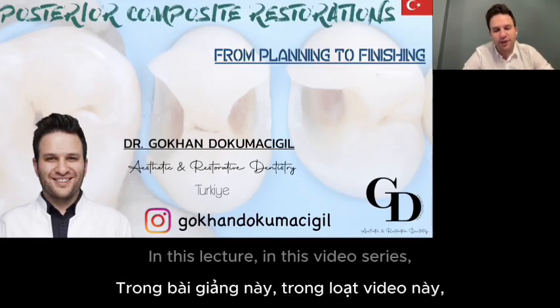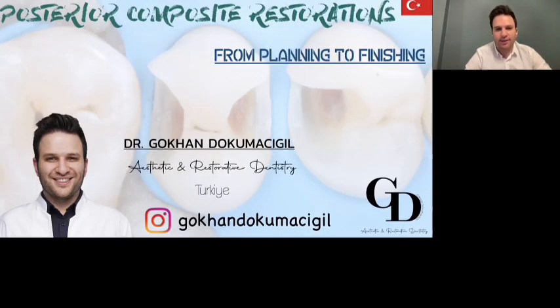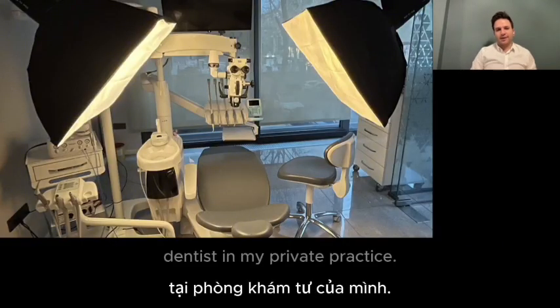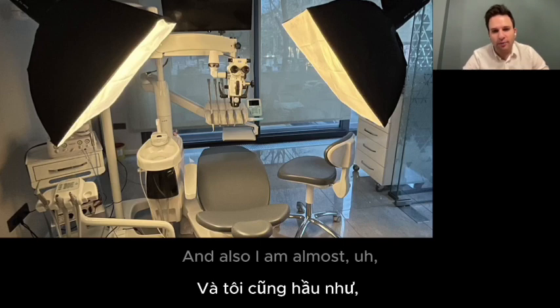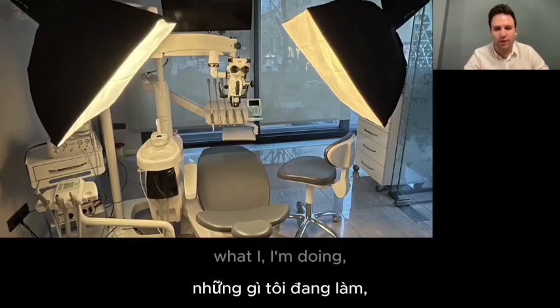In this lecture, in this video series, you will see posterior direct composite restorations from planning to finishing. I'm a restorative dentist specialist, and I'm working as a dentist in my private practice. And this is my clinic, and I mostly work under a dental microscope, and I also take photos of almost all my patients and all the procedures I am doing.